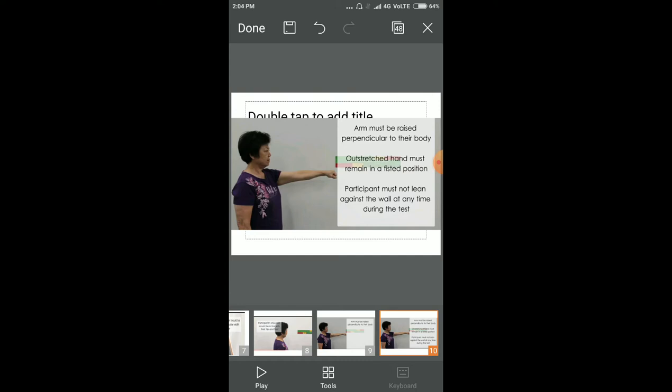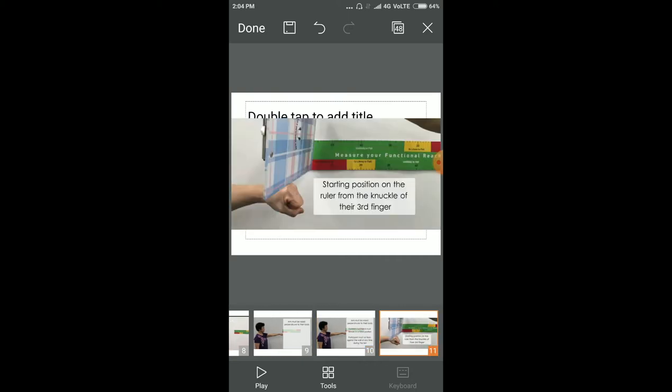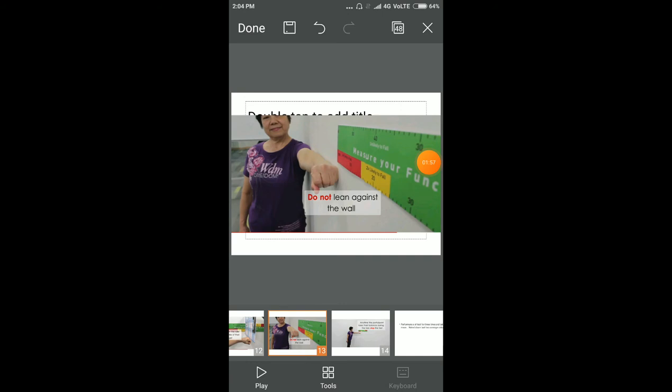Note the starting position on the ruler from the knuckle of the third finger. Ask the patient not to lean against the wall.